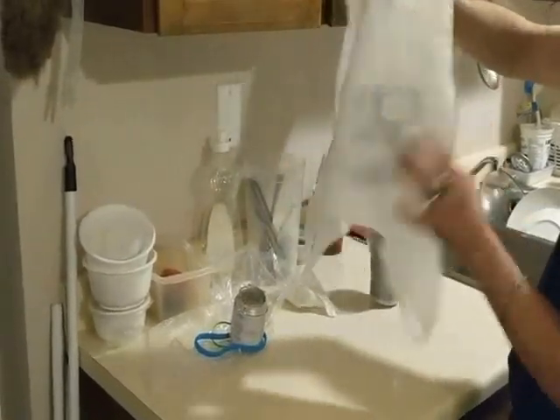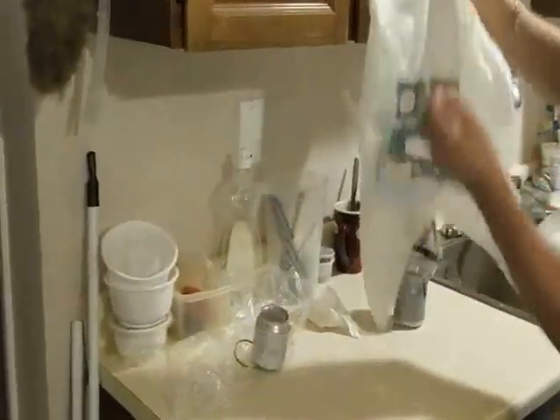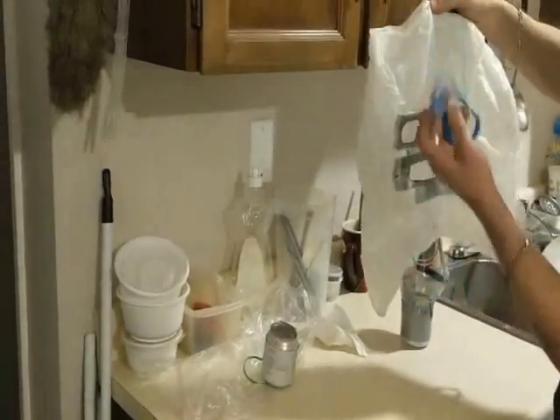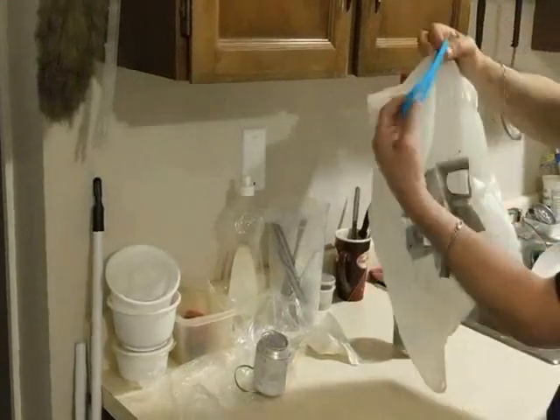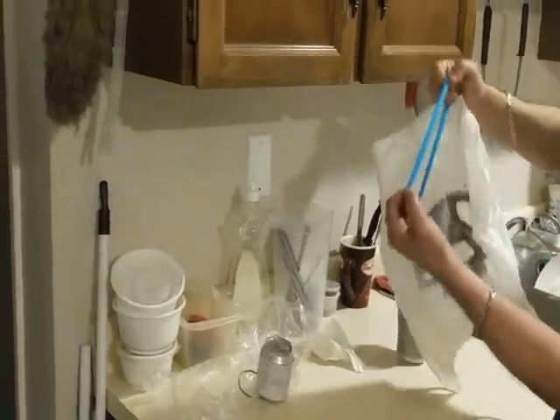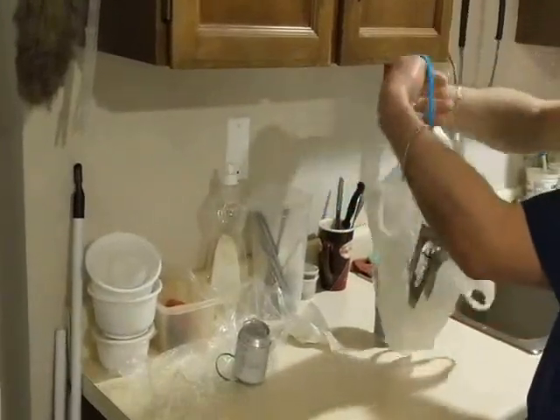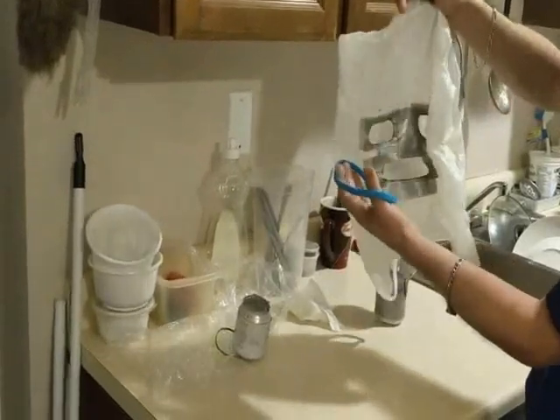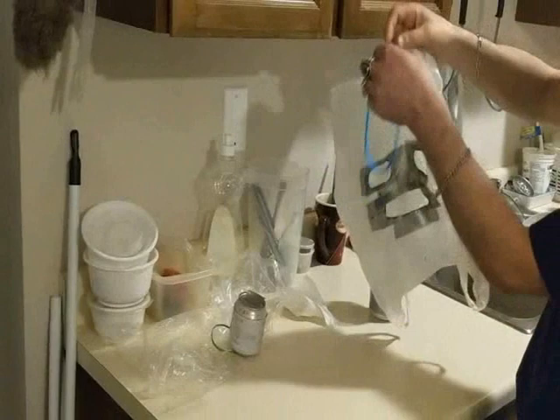Now use and choose a really good bag. So we're going to go on to some details about it, and there's the elastic band. Make sure that it is a larger elastic band, because that'll go over top of your head, and that'll go around your neck to secure the bag around your neck. Make sure it's a larger elastic band, okay? Because you don't want to be choking, so use a larger elastic band. You can get these at the dollar store, very easily to find, okay?